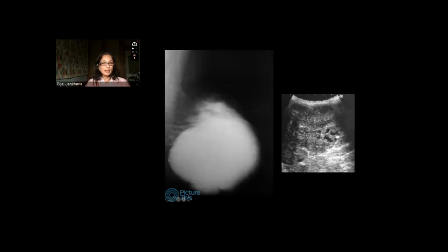Lesions like this, rapidly increasing in size, heterogeneous on ultrasound with cystic clefts within it. Yes, we all know, possibly phyllodes. This would be BI-RADS category 4B. We don't know whether it is benign phyllodes or cystosarcoma phyllodes. Benign, intermediate, and malignant is how phyllodes is divided. This was a benign phyllodes.